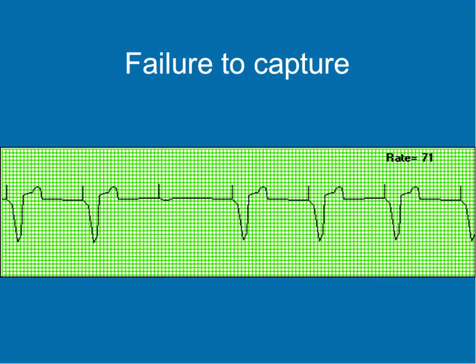Here's a slide of failure to capture. See? There's the pacemaker spike, but it didn't grab it. Now this one grabbed. Okay, so that would need to be looked at to figure out what's going on.